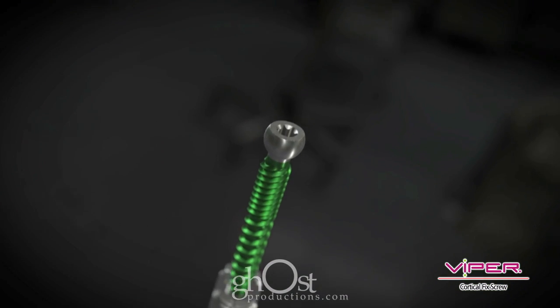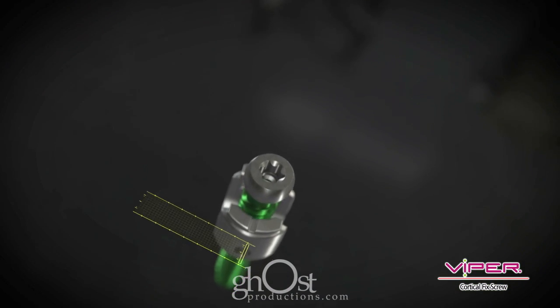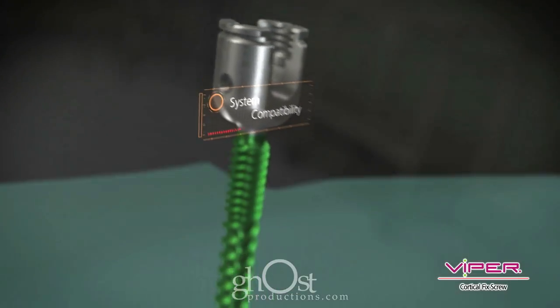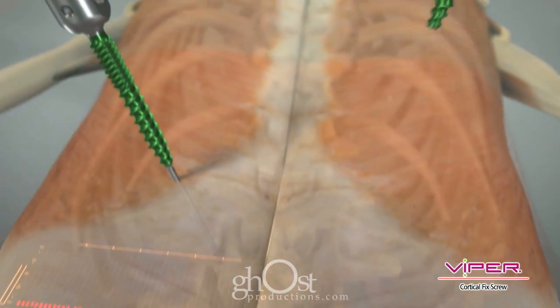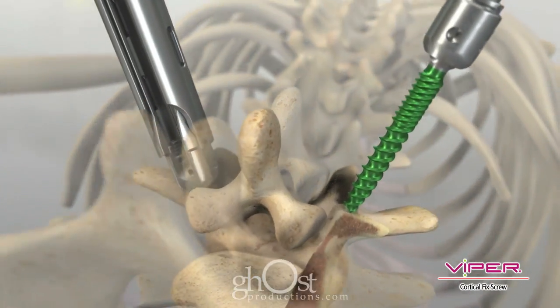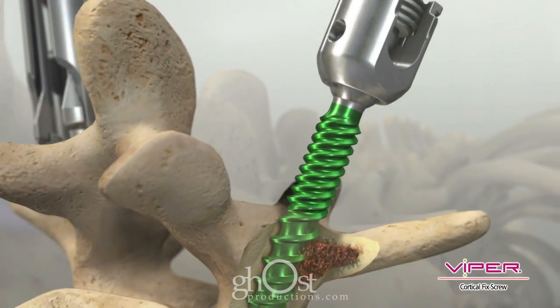All Cortical Fix screws are polyaxial and have the top-notch feature for compatibility with the entire Expedium and Viper portfolios. Screws can be inserted with or without a Viper screw extension for MIS or open surgical approaches.